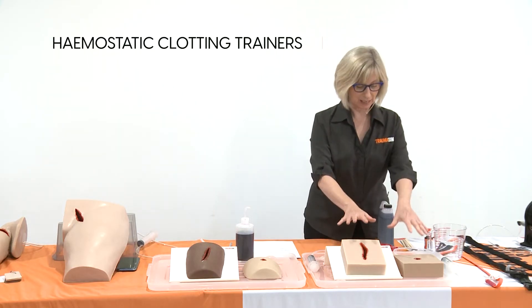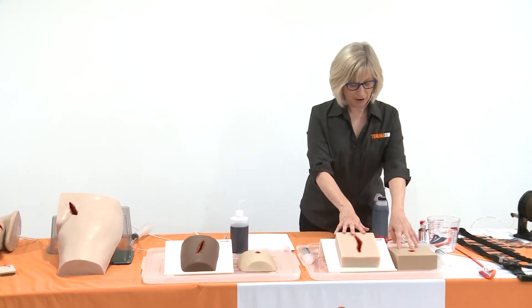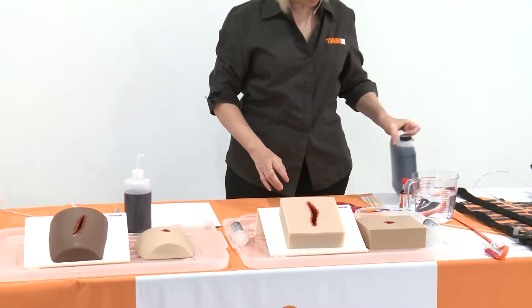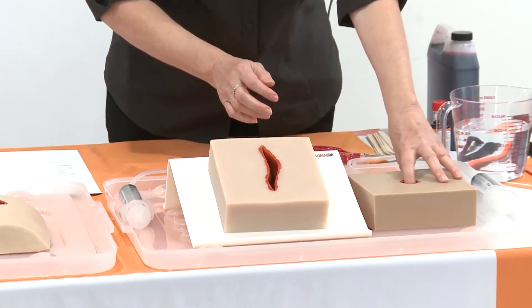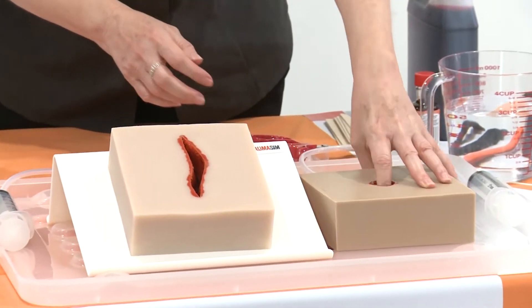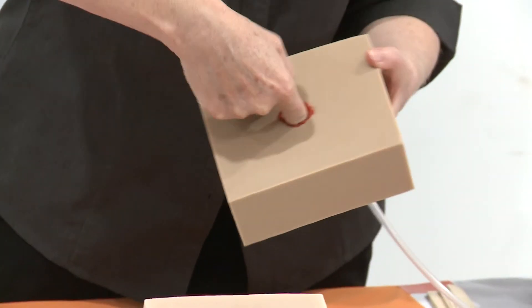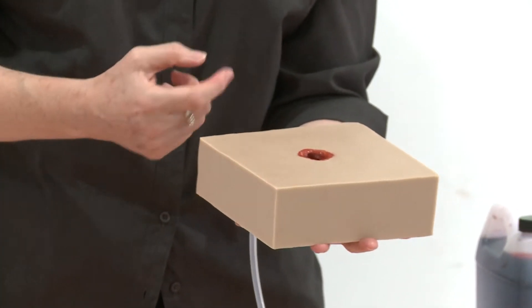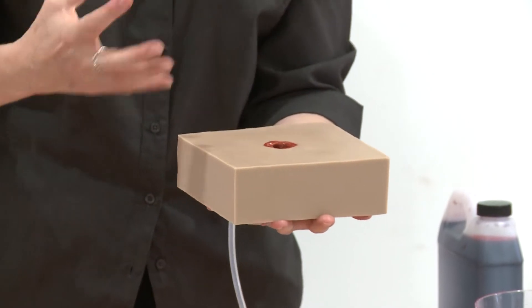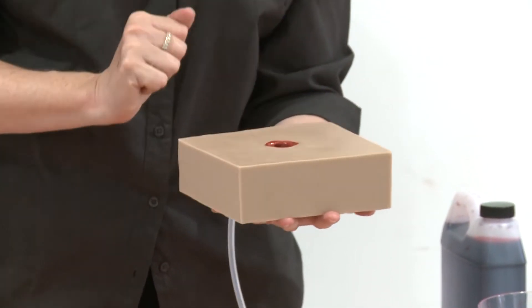Starting with the most basic haemostatic clotting trainers are these ones here. These are our basic squares and we make them as either a laceration or as a gunshot wound. The gunshot wound has a big cavity underneath, simulating the cavitation that happens behind a gunshot wound, which is where all that haemorrhage is going to be happening and that you want to be able to get in there and not just treat it on the surface.